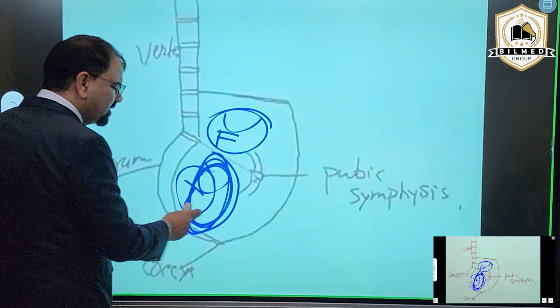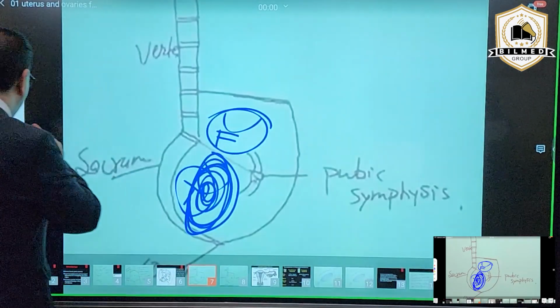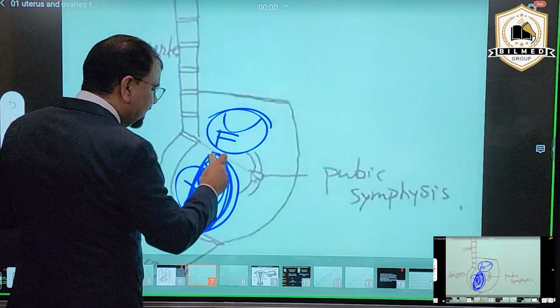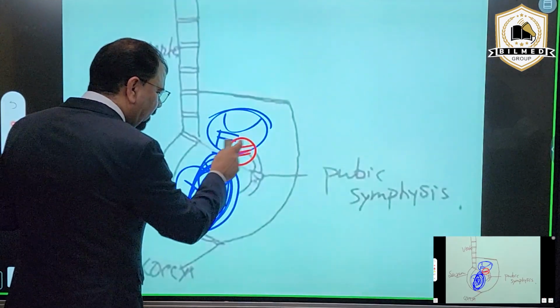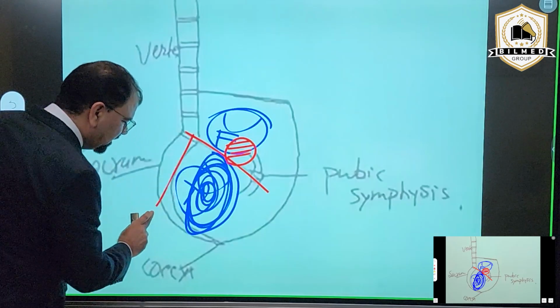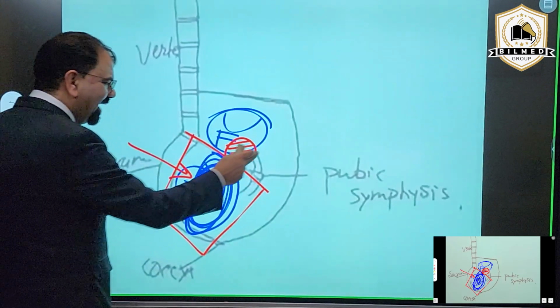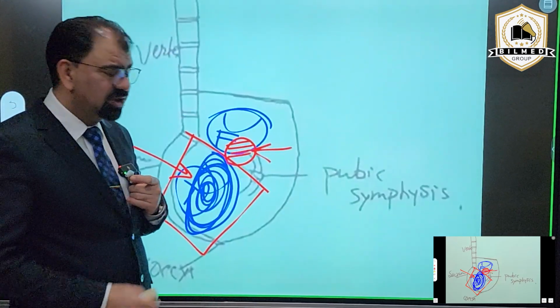If the uterus is crystal clear, there is nothing in the uterus, but maybe there is a pedunculated fibroid, and if that pedunculated fibroid is going into the false pelvis, like here, I will easily miss it, because I am restricting my scan onto the uterus only. The uterus will be very clear over here, and I will miss the pedunculated fibroid which is there in the false pelvis.